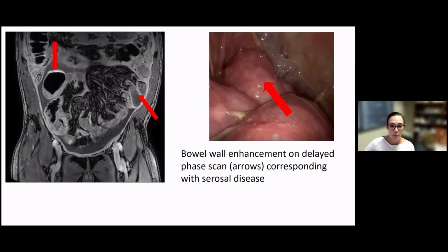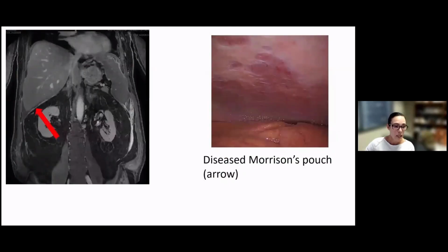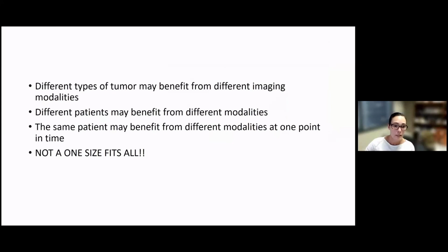And this is the intraoperative appearance that the surgeon saw after we saw this peritoneal lining thickening. Similarly, here we have these very subtle areas that are demonstrating the peritoneal lining thickening. And when the surgeon went in, that's what they saw in terms of the tumor presence.